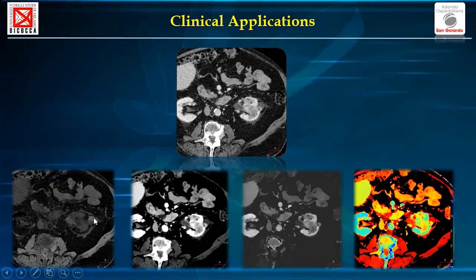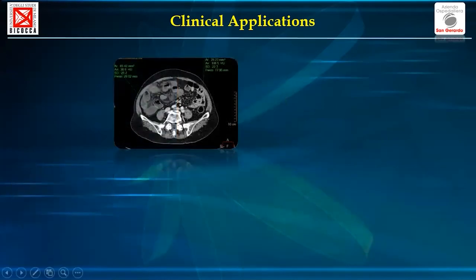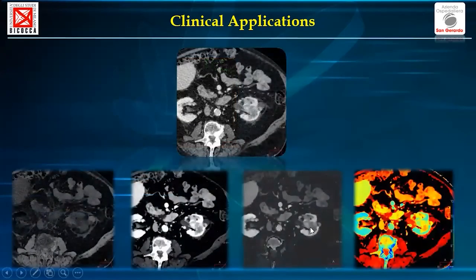And so the upper fluid is blood, while the lower part of fluid is not blood. And if we look at the iodine images, we can recognize the higher accumulation of iodine inside. And so again, we increase our sensitivity.